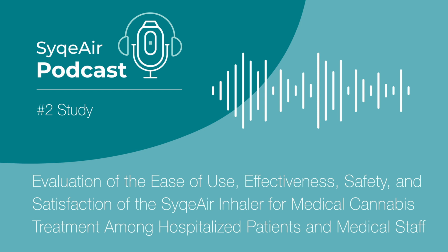Wait, really? I would have assumed that having cannabis readily available in a hospital setting would lead to more usage, not less. It seems counterintuitive, right? But remember, the key here is that metered dose. With traditional methods, like smoking or using less precise inhalers, it's easy to overconsume. The SyqeAir inhaler delivers a specific, consistent amount, which could help patients avoid overdoing it and potentially reduce their overall intake.